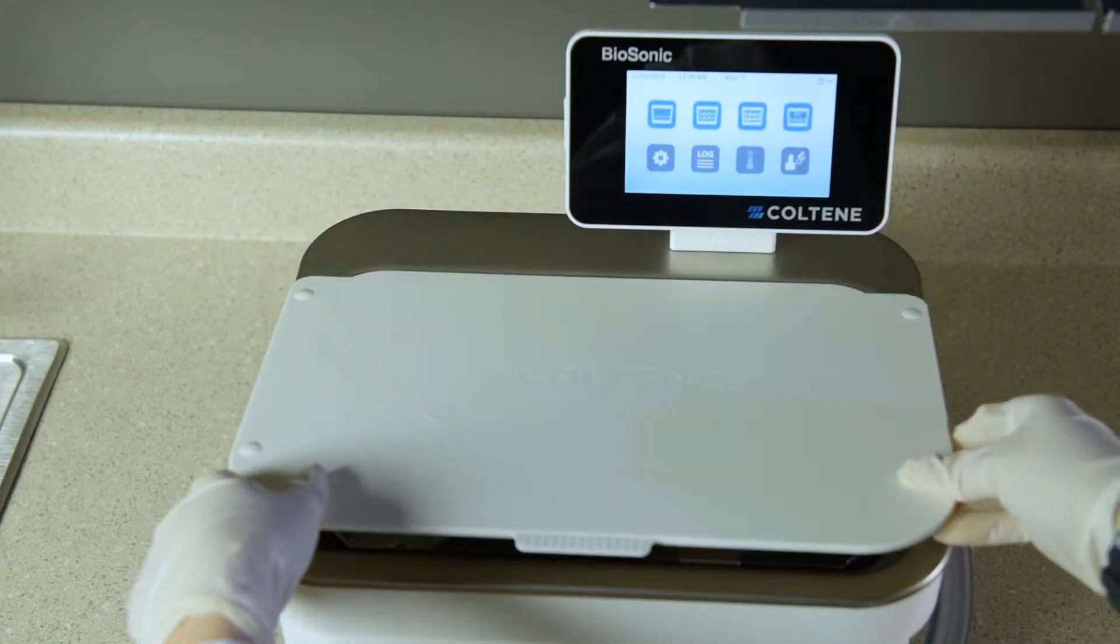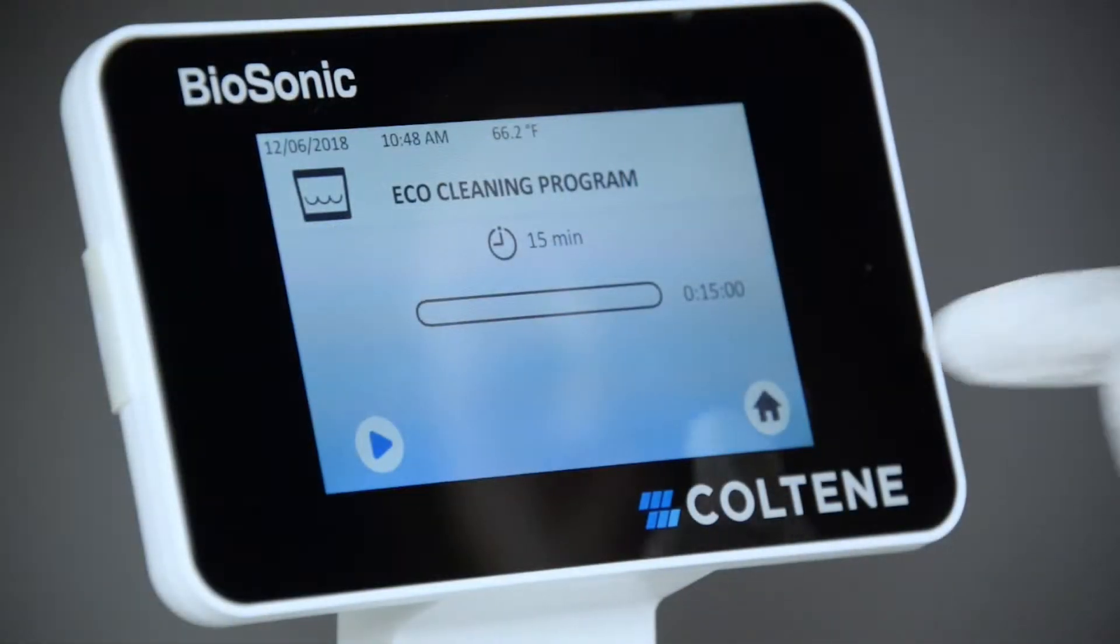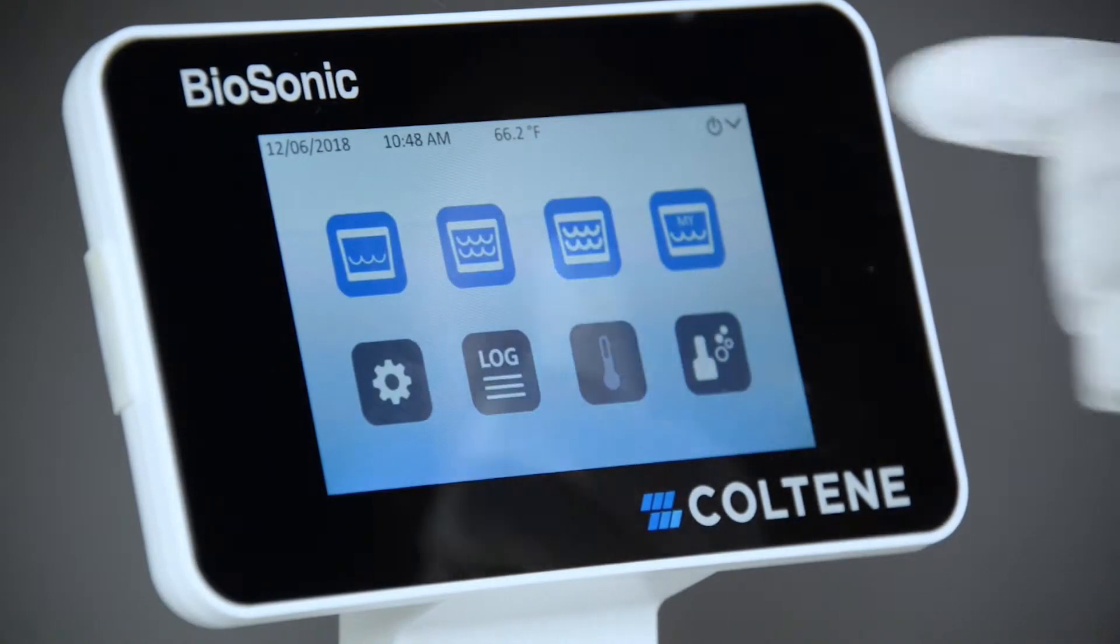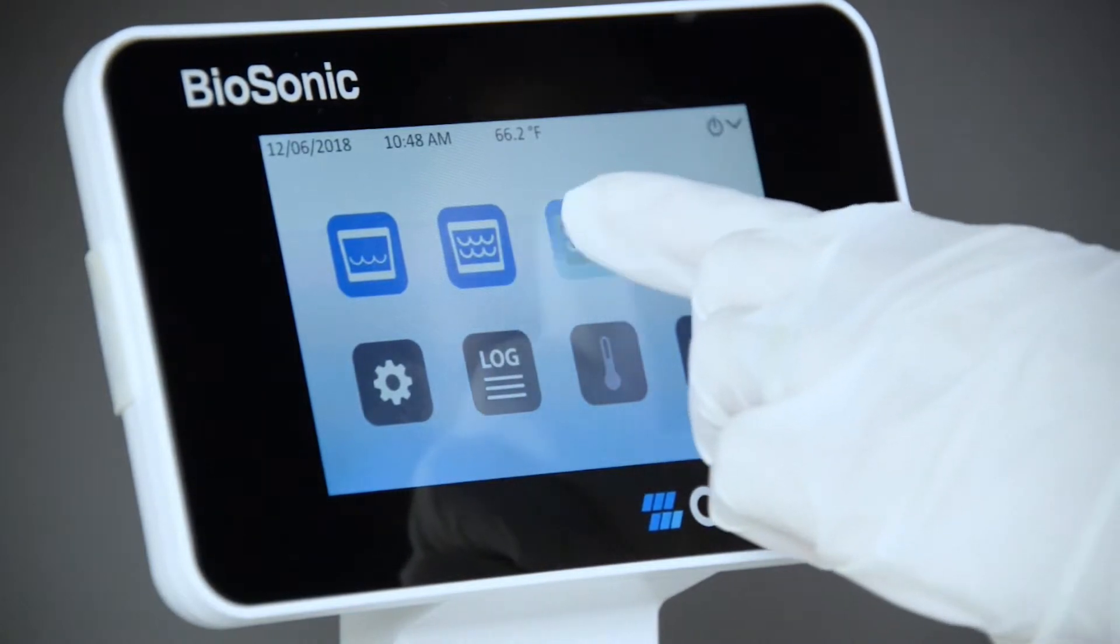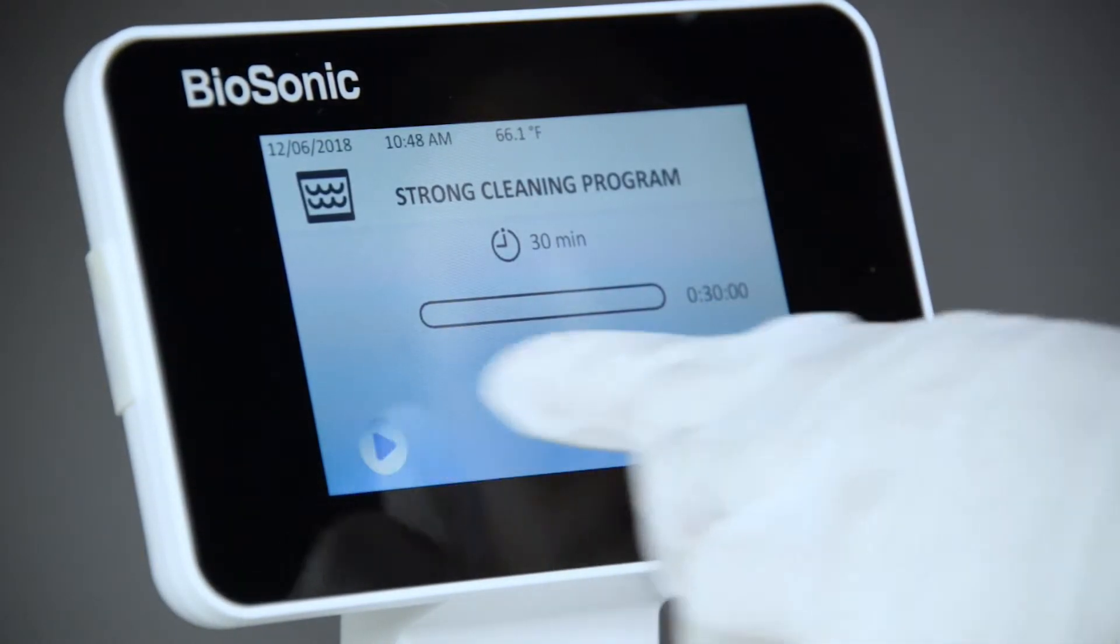If soil is still visible after the completion of a cleaning cycle, modification to one or more parameters may be required. And then additional cleaning cycles may be required until all soil is, at a minimum, visibly removed.